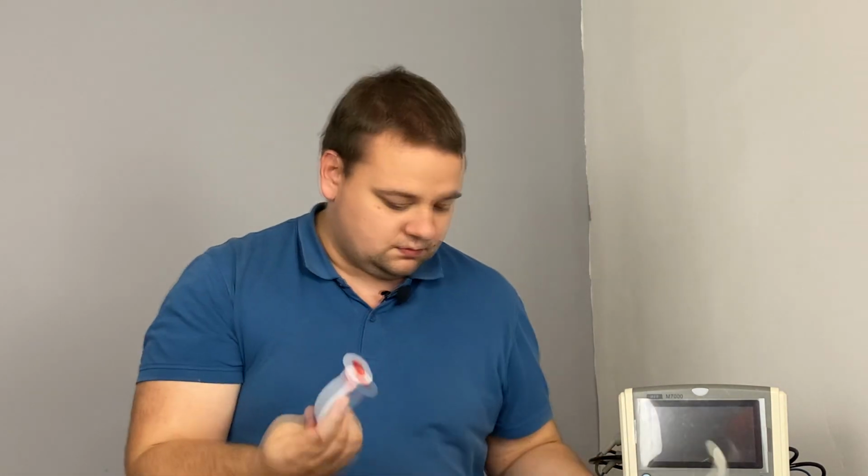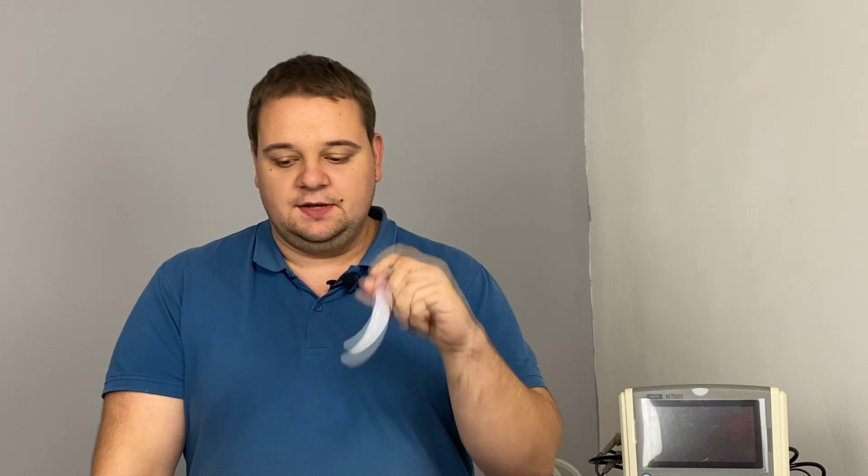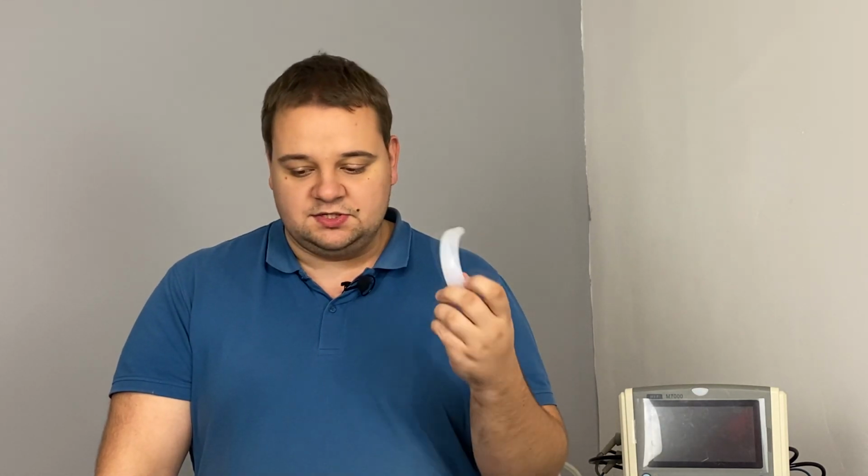There are even larger ones like this one. So we get the idea. They are transported together in a set, and when you look at the patient, you may select the correct size. How do you do that? You place the tube near the patient so that the outside part is at the level of the teeth, and the inside part must be at the level of the angle of the jaw. So this one is all right for me, for example. And of course, you select which one is needed, then you insert it into the patient. More on that later.